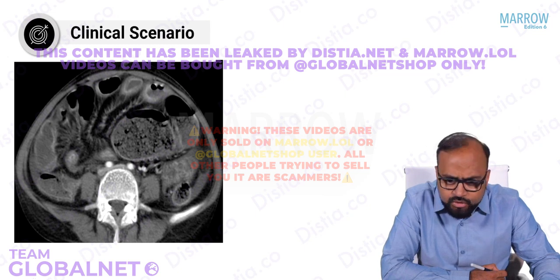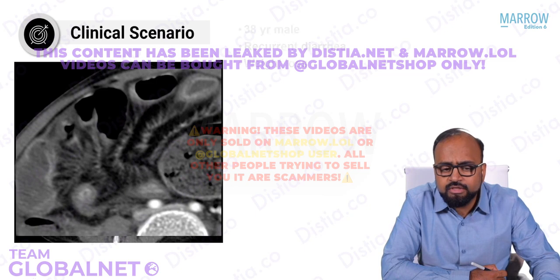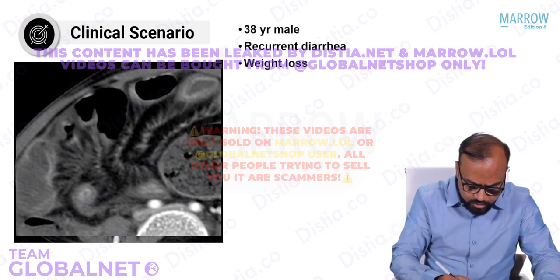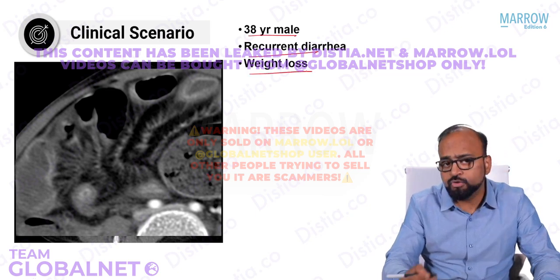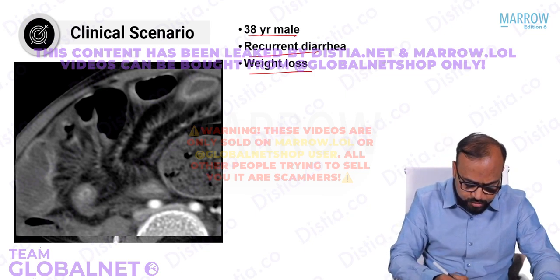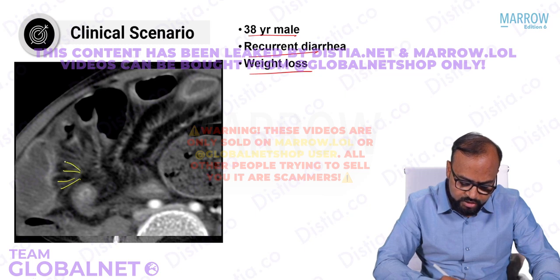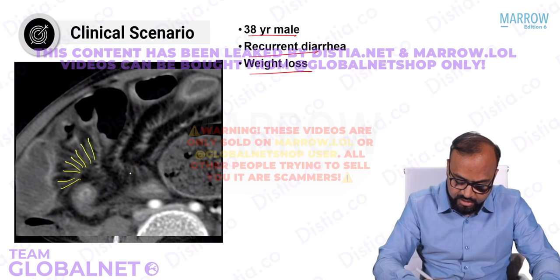Yes. Now see here, this is a patient who actually presented with repeated episodes of diarrhea. A 38-year-old male presents with recurrent diarrhea and weight loss. Why? Because if you see, the bowel loops are appearing inflamed, especially if you watch carefully along the mesentery. Can you see these prominent blood vessels? There is a hypervascularity in the mesentery. These blood vessels are traveling towards the adjacent bowel loops.